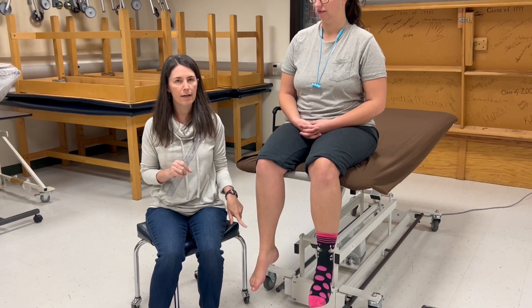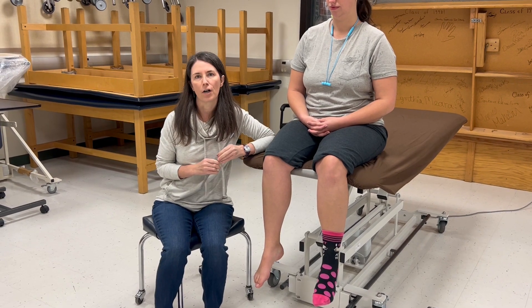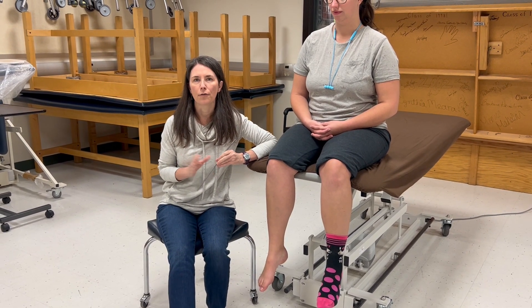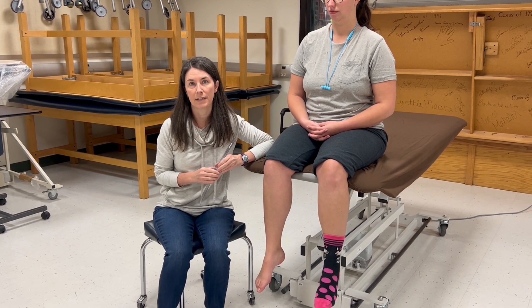We are going to measure inversion and eversion in the frontal plane. Both have a firm end feel. The normal value for inversion is 0 to 35 degrees and for eversion is 0 to 15 degrees.